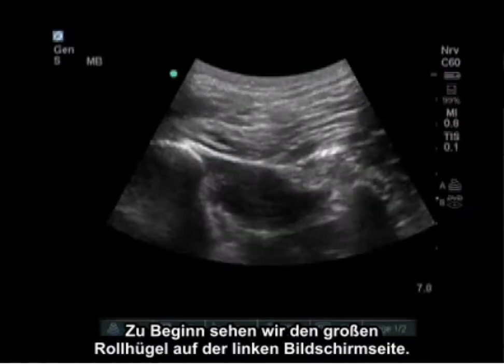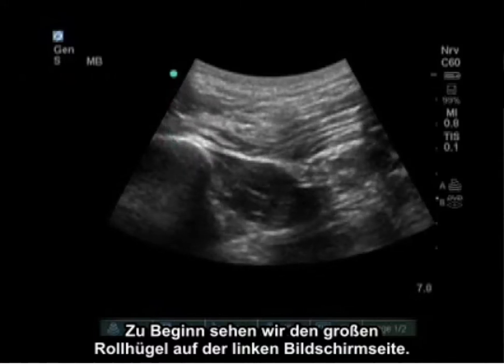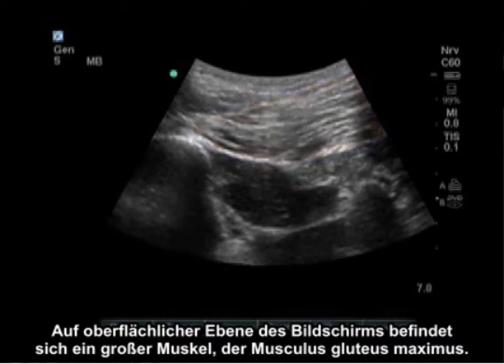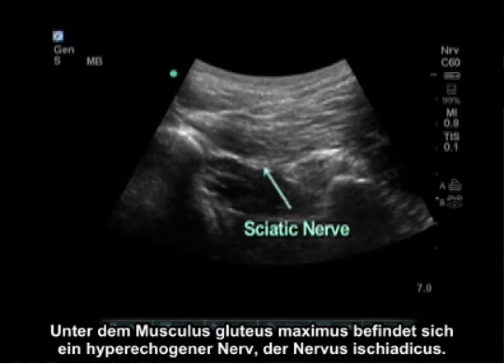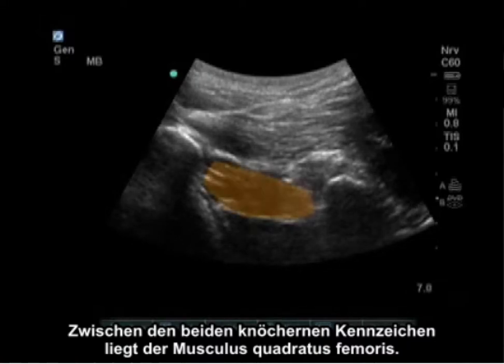Directly in between these two landmarks is where we place the probe. The initial view shows the greater trochanter on the left side of the screen and the ischial tuberosity on the right side of the screen. There is a large muscle, the gluteus maximus, at the superficial level of the screen. Underneath the gluteus maximus is a hyperechoic nerve — the sciatic nerve. Between the two bony landmarks is the quadratus femoris.